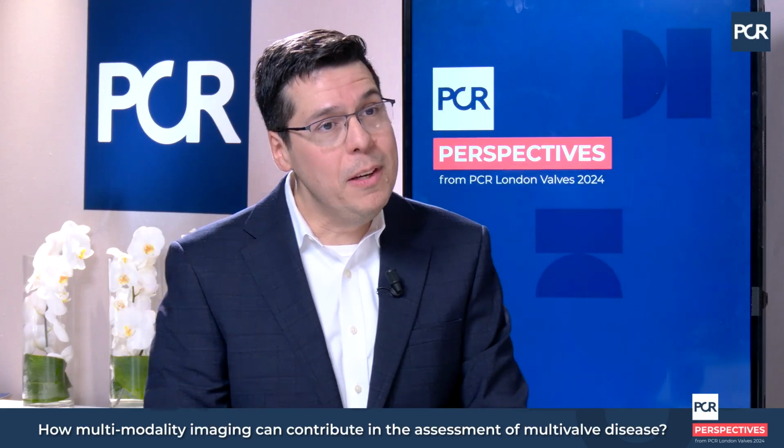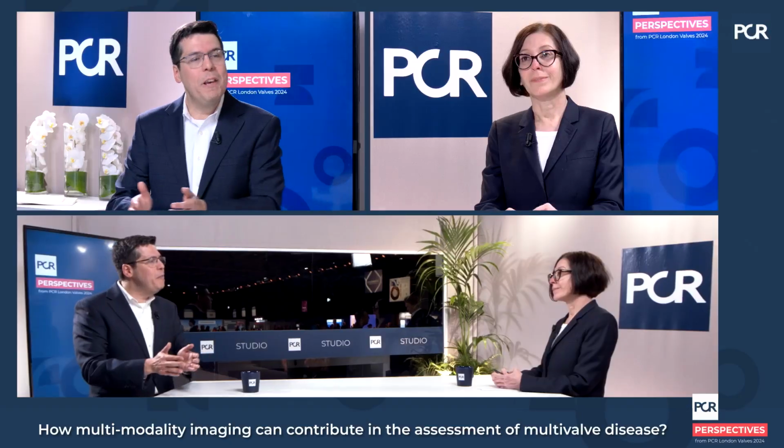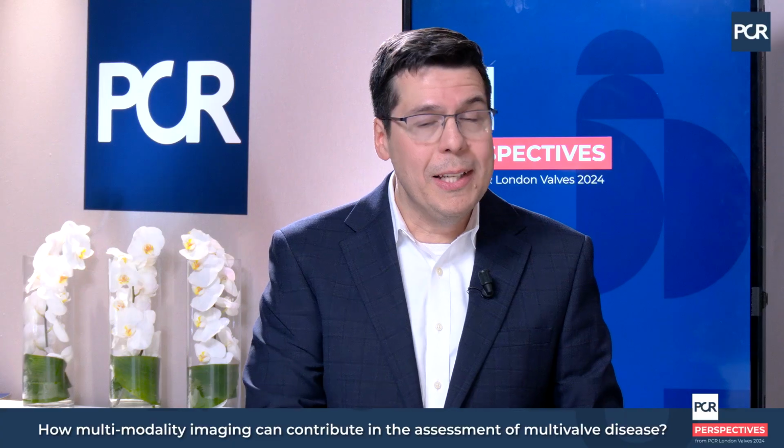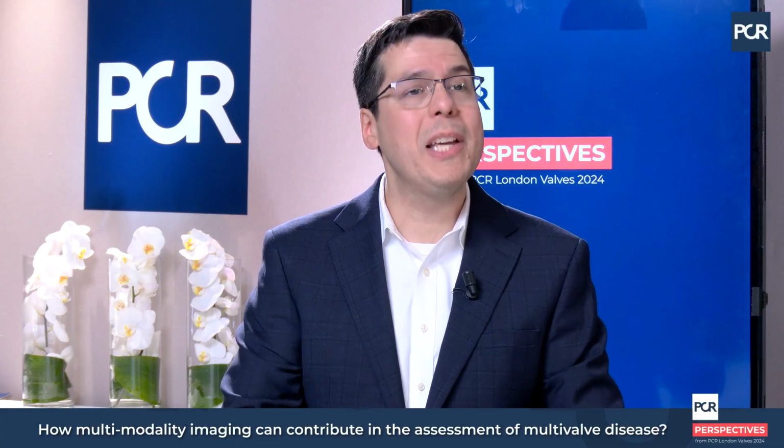When you have, for example, now two regurgitations in separate ventricles, mitral and tricuspid regurgitation, very common. Severe secondary mitral regurgitation, almost half of these patients will have TR. If I tackle the mitral, what happens to the tricuspid? Do I need to revisit that? And that's where cardiac MRI can come in. Assessment of the remodeling, assessment of the severity in each one of these two chambers. Because we understand nowadays that just doing a job in one valve might not be enough.